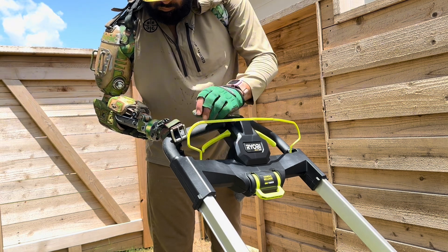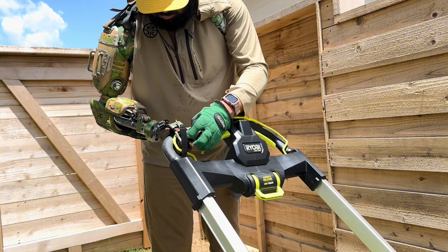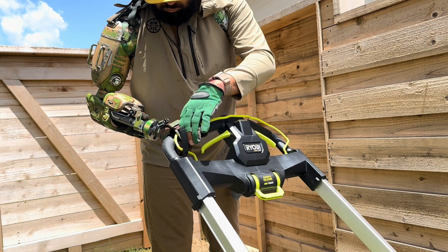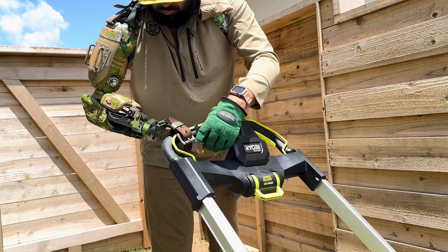I double-stranded and coated the 550 cord. I do go through these occasionally, but I've only had to replace it once since coating it — it didn't break, I just caught it before it would have. It's been almost six months without a replacement given how much I use this elbow, which is pretty good compared to steel and wax. When I say the elbow is disconnected here, in layman's terms that means I cannot operate it bionically — and when I say bionically I don't mean battery-powered, I just mean actively controlling it via a cable system.